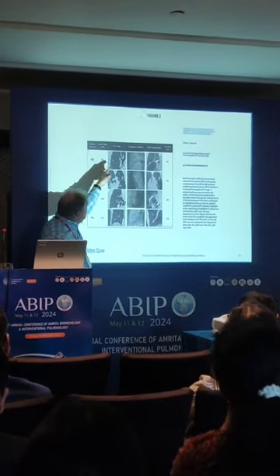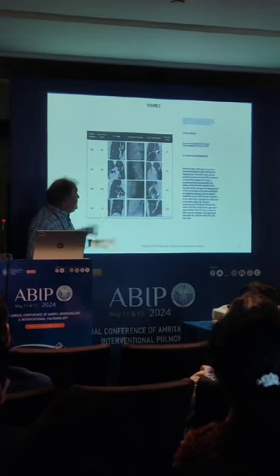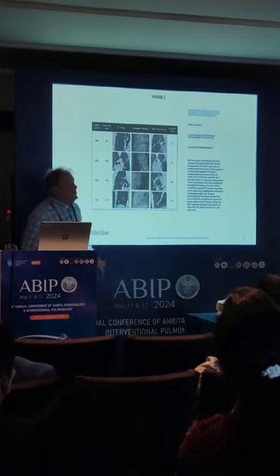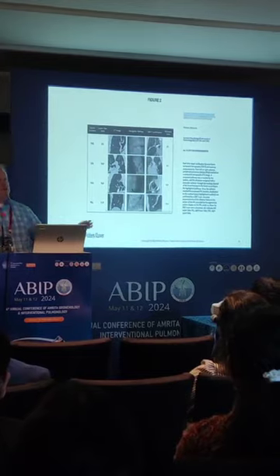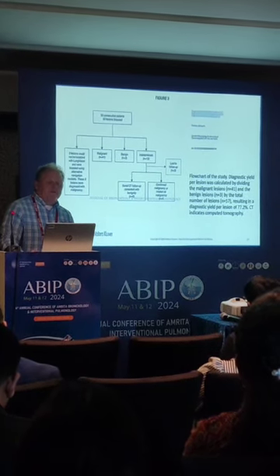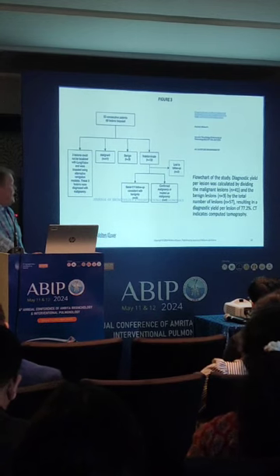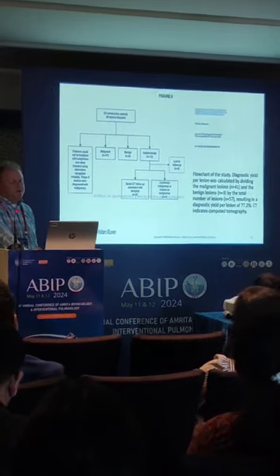There is the CT image, there's the tomosynthesis image. So you get quality, and then by the way, this was comparison to CAT scan, so the navigation pathway, and also to cone beam. And was it comparable? Because the whole idea here is, if cone beam's the gold standard, what does this do for you? Well, at their time, they got a diagnostic yield of only 77%. Now again, they weren't using any other kind of advanced technologies, and this was the first version of the software. I'll show you some updated literature, but just to whet your whistle.